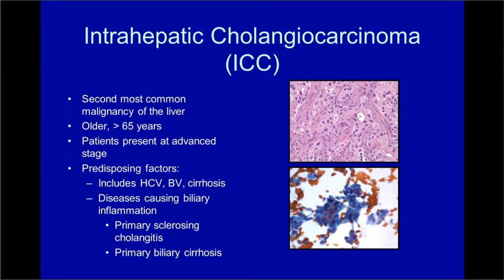to see on fine needle aspiration. But you should be aware that cholangiocarcinoma can have a variety of other patterns, and that you may also encounter these on cytology, and that those other patterns do not exclude a primary carcinoma diagnosis.